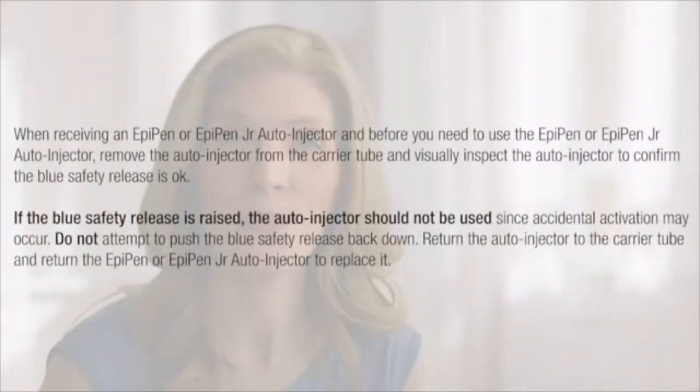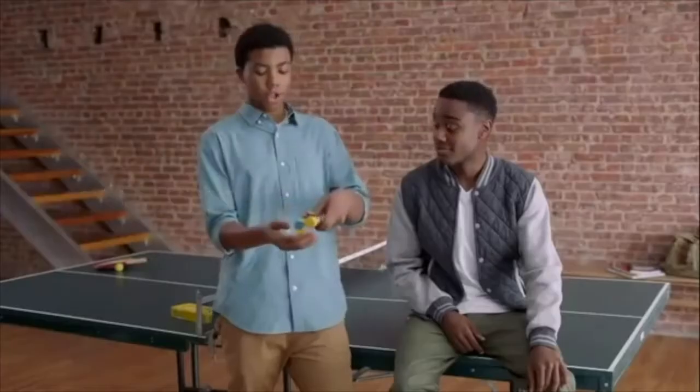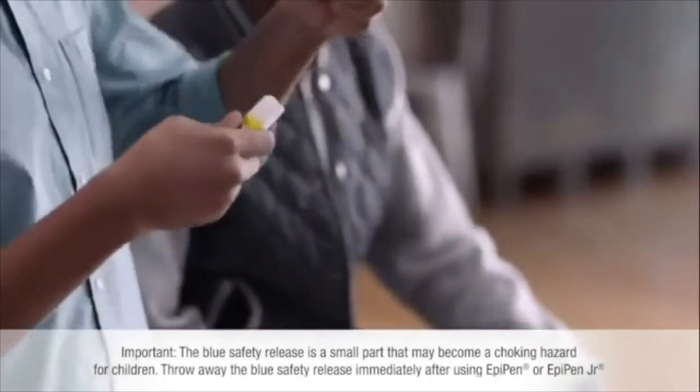First, take it out of the tube. Flip open the yellow cap or the green cap, and slide it out. Hold it like this — blue to the sky, orange to the thigh. Then take off the blue safety release cap.